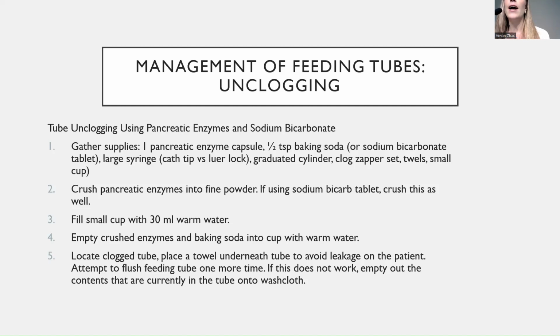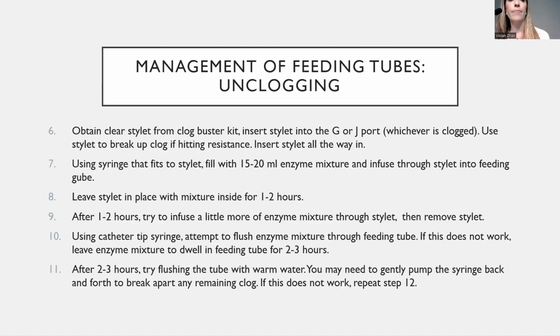So what I try to do is flush the feeding tube one more time with warm water, because sometimes the nurses have been maneuvering it a little bit, and maybe they actually got it a little bit unclogged in the time frame that it took for them to come and get you. So flush it one more time. If it doesn't work, then you want to get all of the residual contents out of the feeding tube, so kind of squeezing the tube a little bit onto a washcloth.